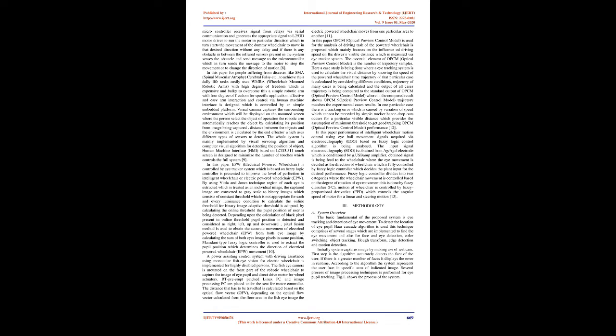According to the position of the pupil, the motors attached to the wheels of the wheelchair are directed to move according to the desired direction. If there are any obstacles in the direction of motion, an ultrasonic sensor senses the obstacles and stops the movement or changes the direction of movement automatically. A Raspberry Pi is used as the control unit which allows the system to access the control.